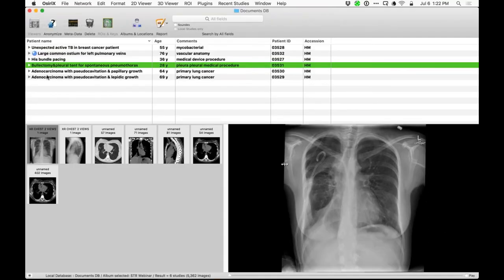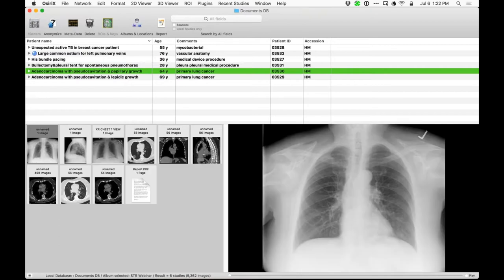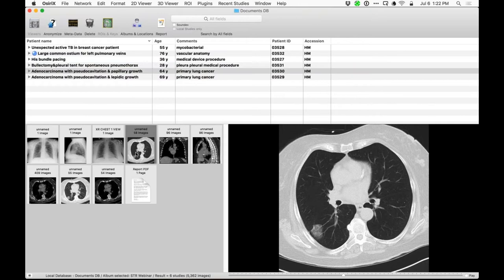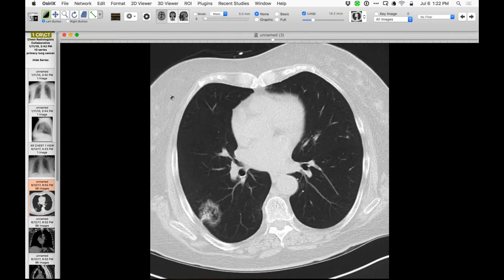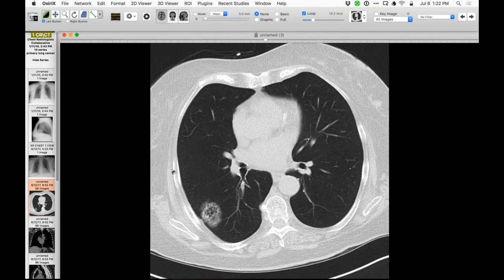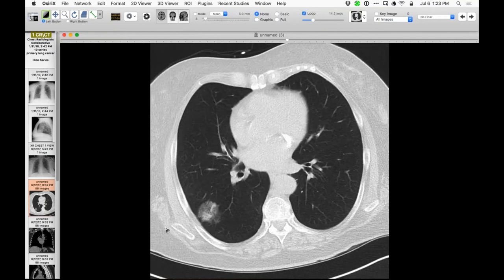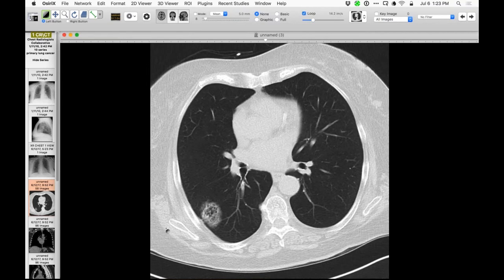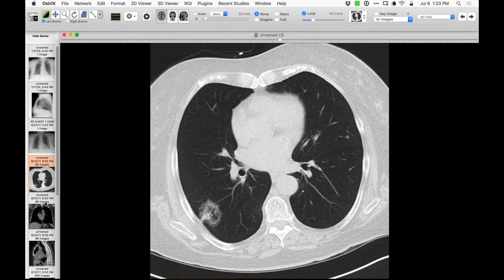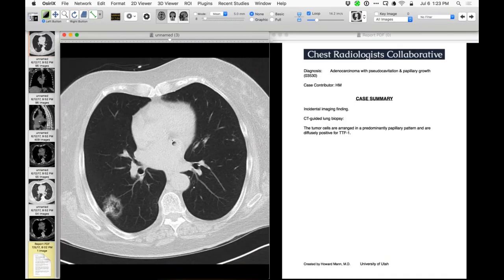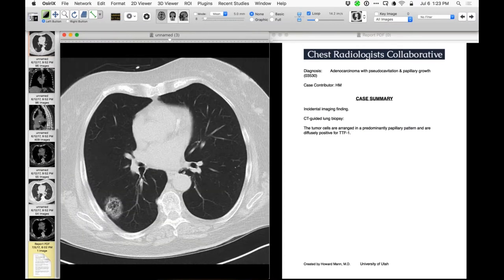These two cases are interesting - both turned out to be incidental findings. This first one is an adenocarcinoma and is a very nice example of an adenocarcinoma in which there is pseudo-cavitation with distorted air spaces. It's a lesion with both solid and non-solid components - ground glass as well as more attenuating opacity - with very strange air spaces within. This is very typical for adenocarcinoma.